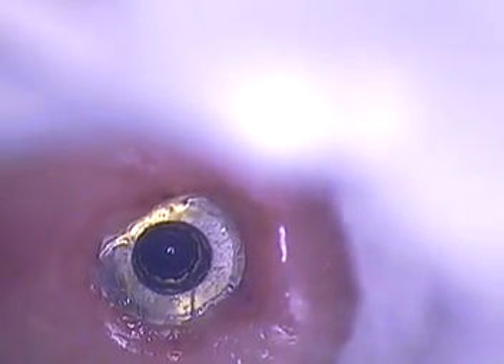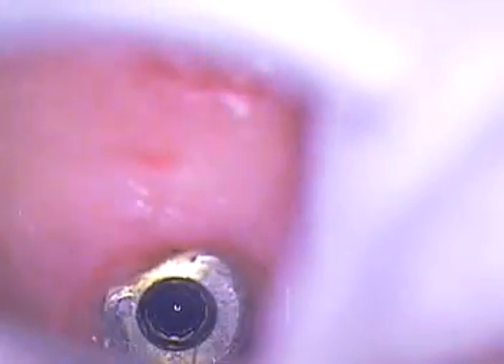They're not going to reuse those tips, so we can go in there. One of the threads is a little bit larger than the other — the molar is bigger. They're color-coded blue and yellow, two different sizes. All right, very nice — nice result.